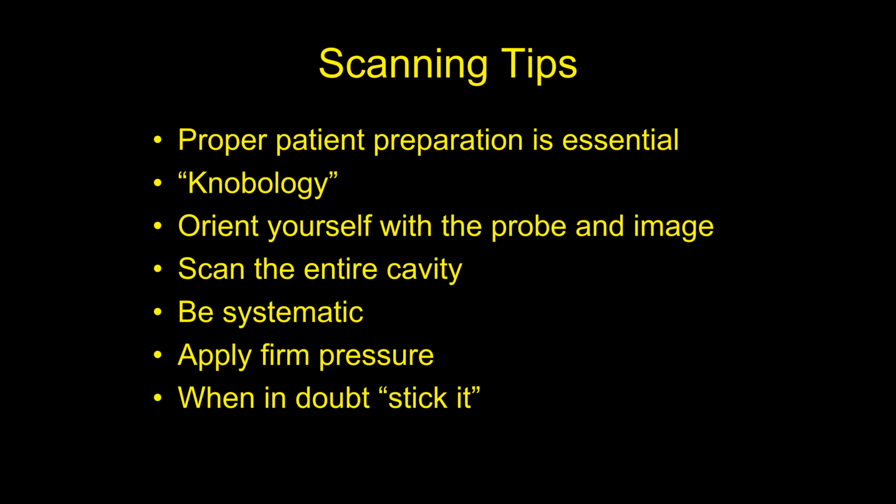Okay, when you get ready to scan an animal, and unfortunately, Zoom-wise, it doesn't work out too well for us to do an ultrasound lab and scan an animal and put a probe in your hand. But a couple of things to keep in mind when you get ready to do one of these in your world is proper patient preparation, which is hard to say really fast, is essential. And so what do I mean by that?